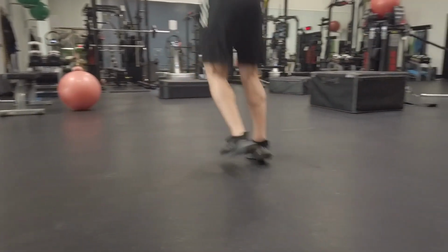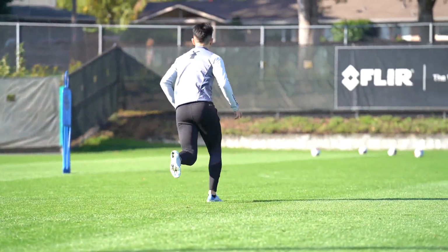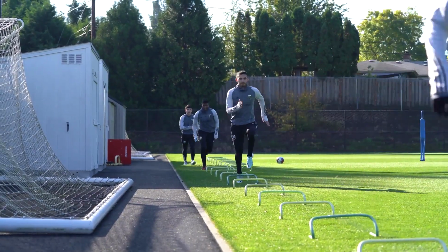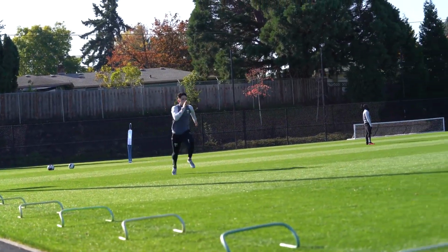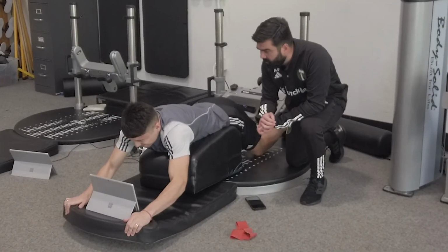Player profiling, especially hip internal-external rotation or total hip profiling, has become one of the standards for the club. And again, we can utilize this time during a return to play process to address areas that we found during their profiling. With the high-speed running that we start to achieve later on in the return to play process, it's important to see what kind of recovery we're getting in the hamstrings. And using the KangaTech system, we're able to track whether or not a player is recovered from one session to another.